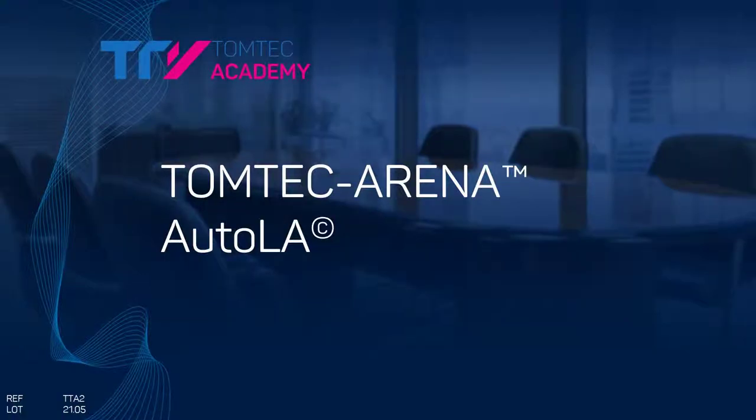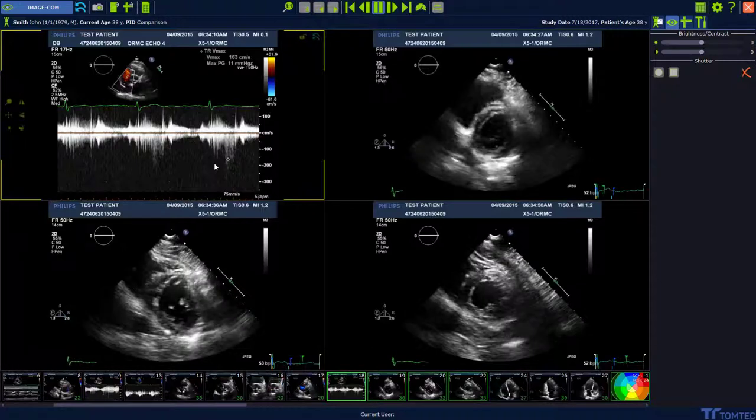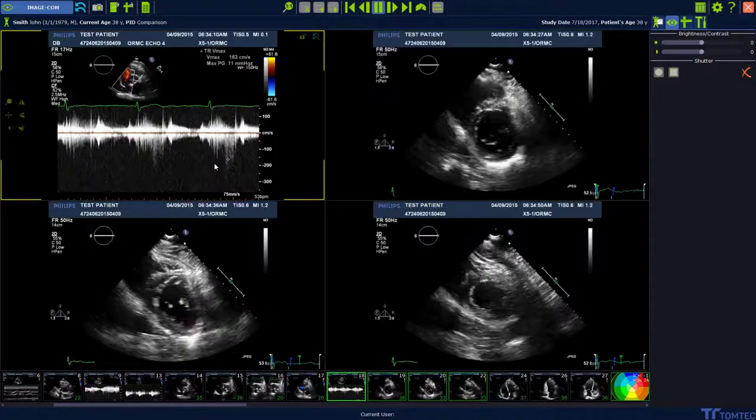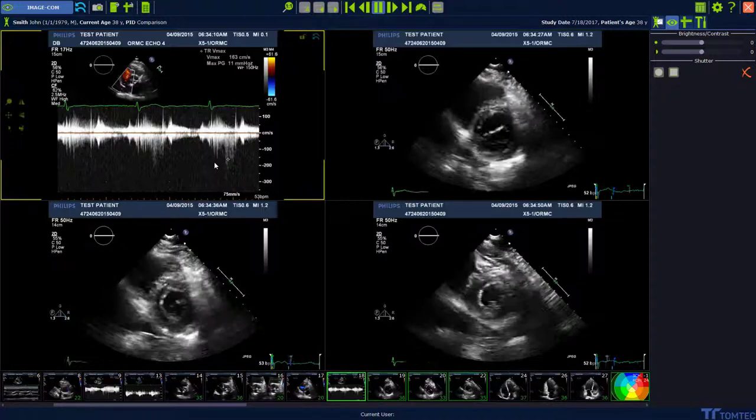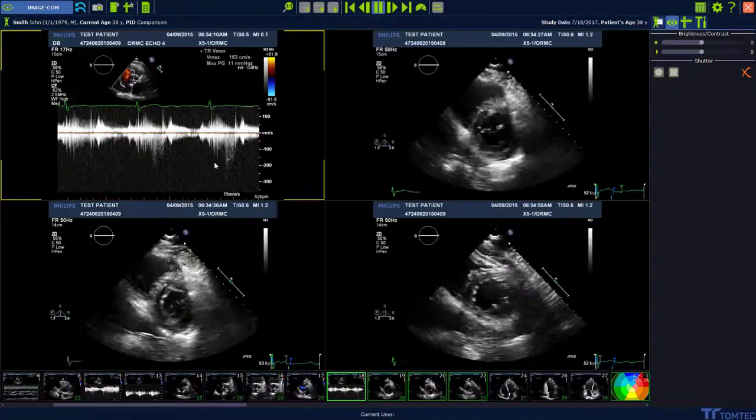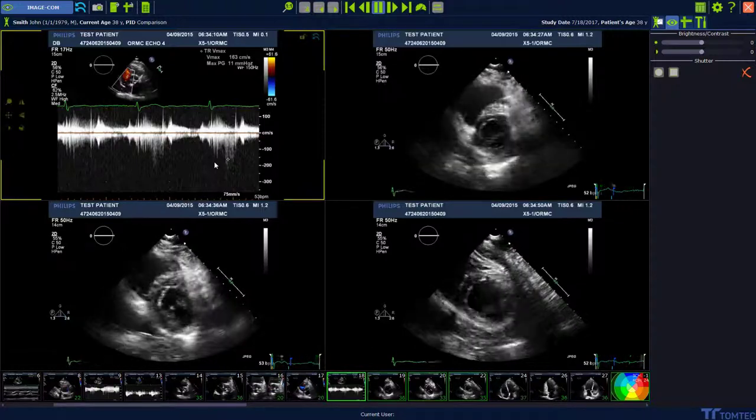Welcome. Today I want to show you how to use AutoLA. AutoLA performs automatically a biplane volume quantification of the left atrium.